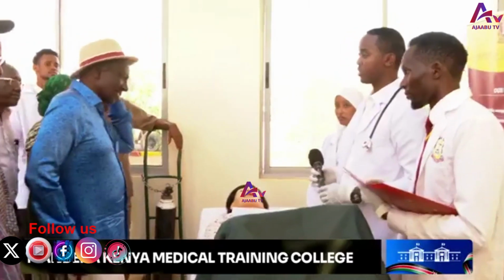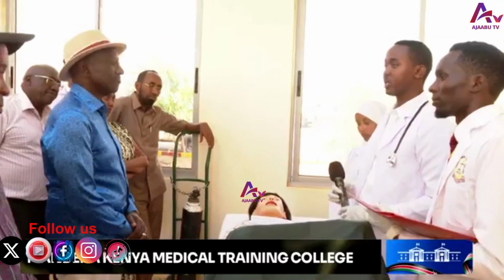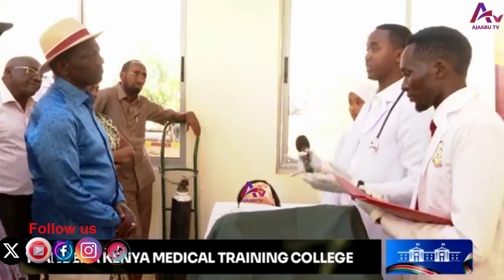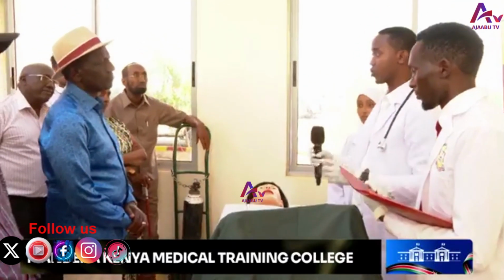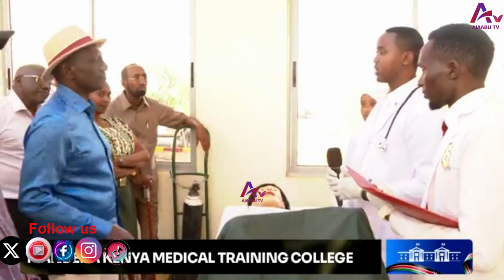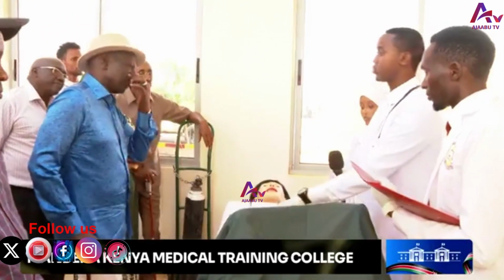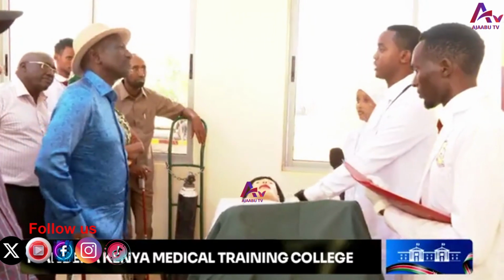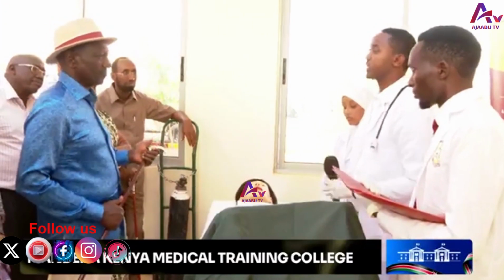Before you is a patient that has a problem with bladder incontinence, maybe as a result of a health-related condition, or even growth within the routes that the urine passes. They may get obstructions, and this will lead to urine accumulation in the bladder. So when a patient develops such conditions, we have a procedure for them, and that procedure is catheterization.